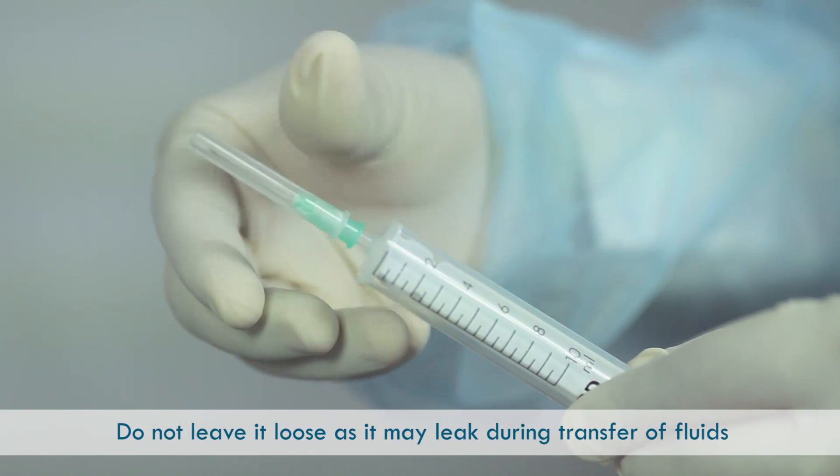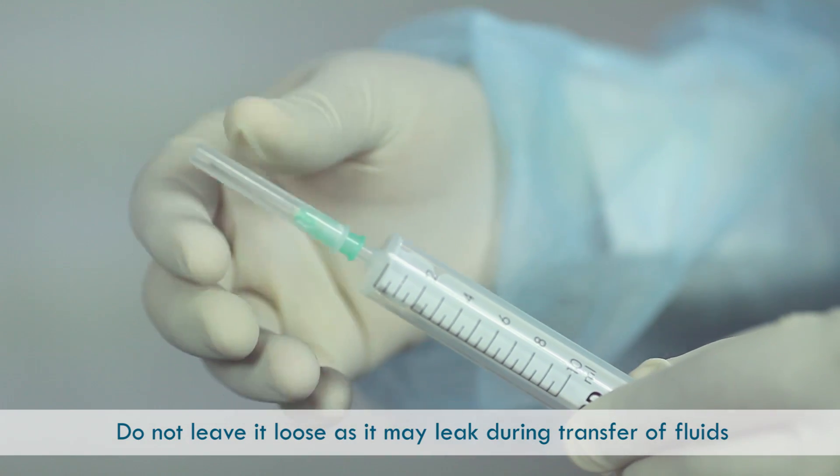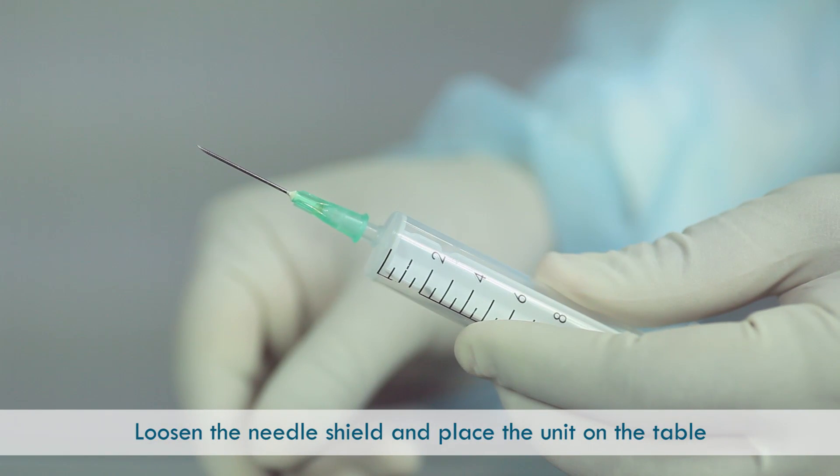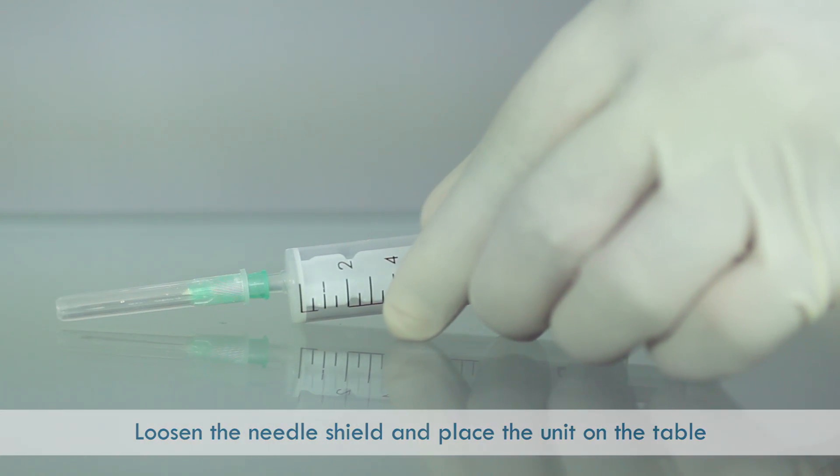Also, do not leave the needle loose, as it may leak during transfer of fluids. Loosen the needle shield and place the unit on the table.